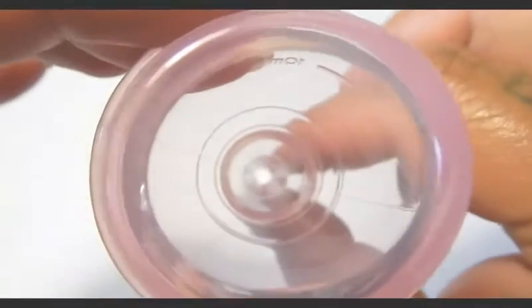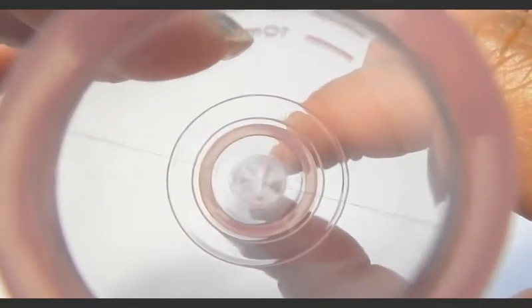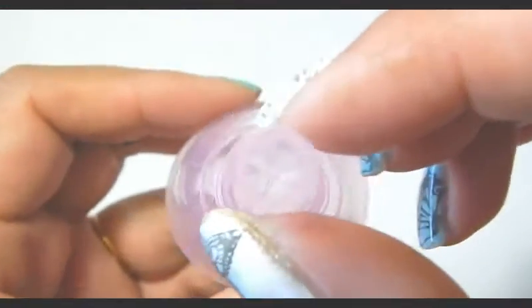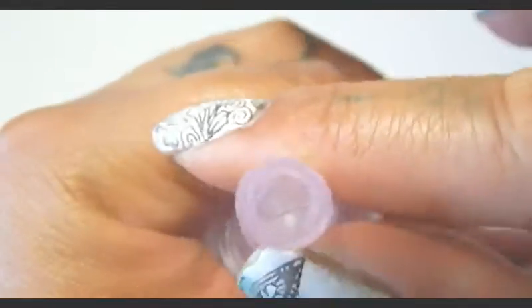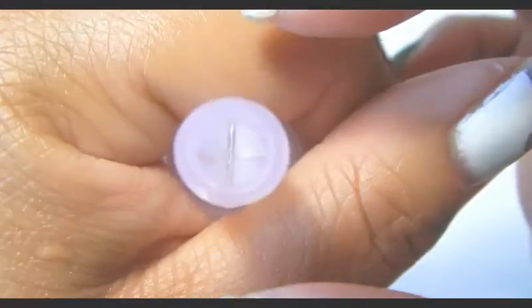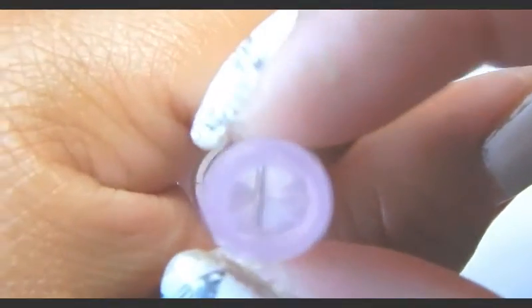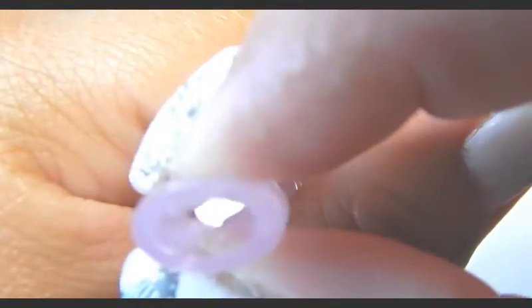I'm bringing this close up so you can see the side view of the teat separating. Let's see if you can see it from the inside of the cup — focus on the inside. I think that's the clearest shot I'm going to get, and there it is while it's opening.